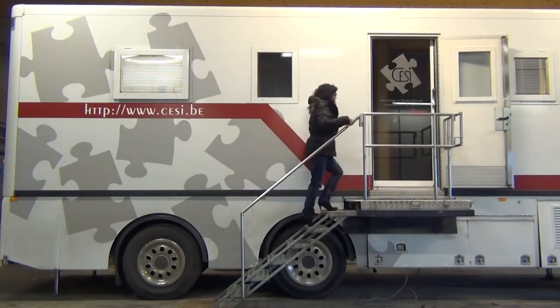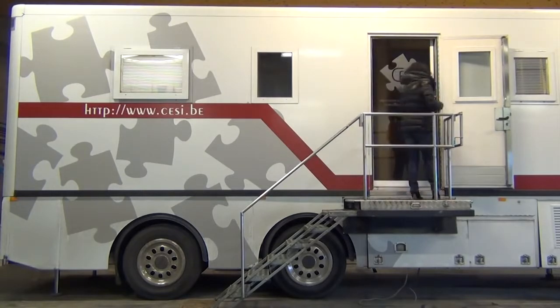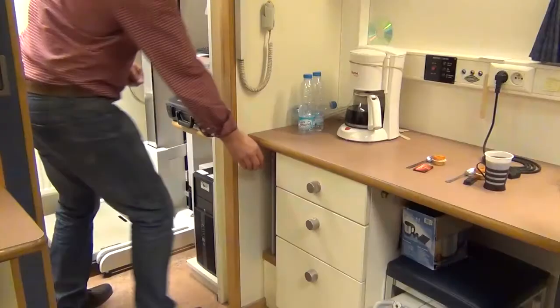Mobile units are mostly used for screening and medical check-ups, to improve accessibility and to reach higher participation levels.